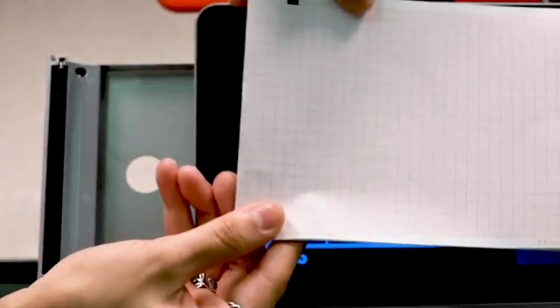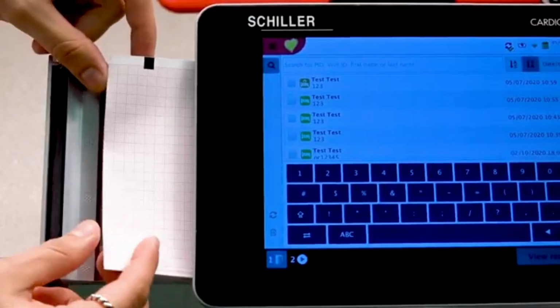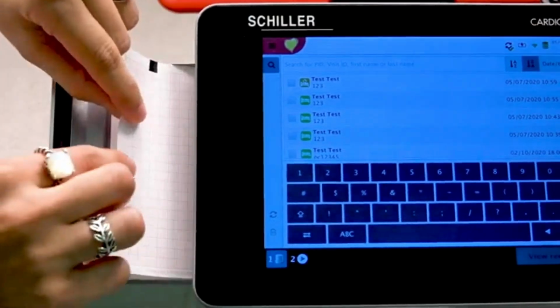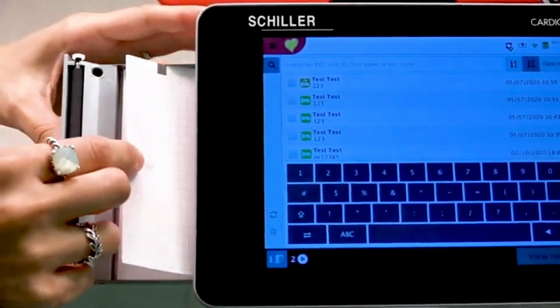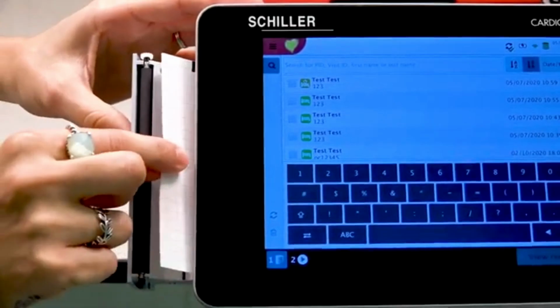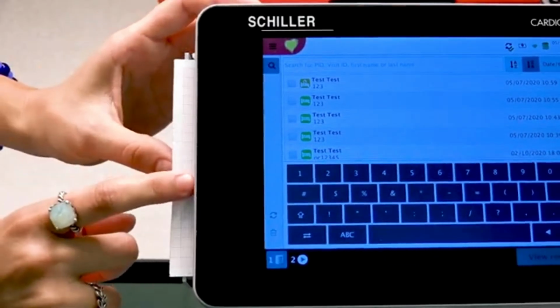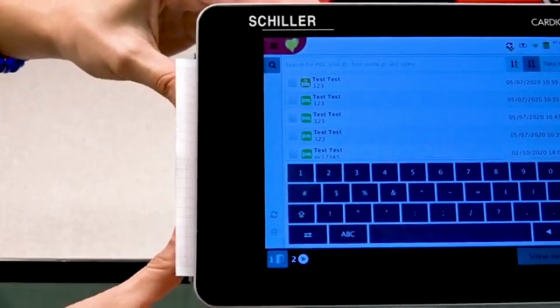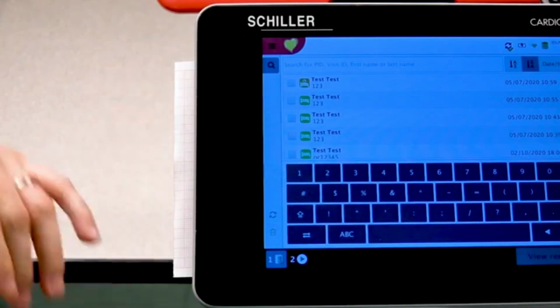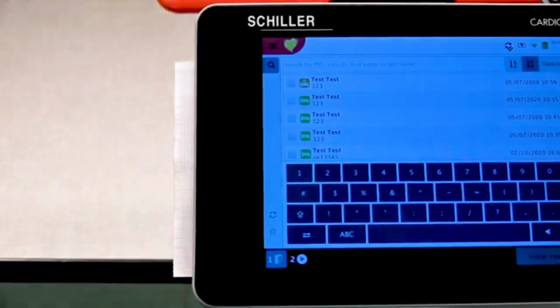So we're going to go ahead and grab this pack of paper and slide it into the paper drawer. It's important to lift up that first sheet of paper and gently start sliding the paper drawer and slightly tug on the paper. While you pull it out, press into the paper drawer, securing that it's closed, and leave a little bit of paper hanging out. Now you have properly replaced your thermal print paper.